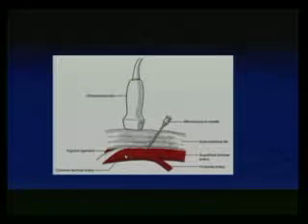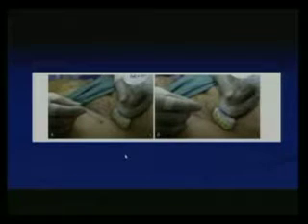So it's easy to see the needle tip when it's very close to the ultrasound probe, but the angle is not right to get your wires and sheaths in. So you have to be very careful when you do that. So this is demonstrating the same concept I just talked about. If it's very close to the ultrasound probe, most of the time it's easy for you to see the needle tip, but you can lose the needle tip as well. But the angle, like putting the wires and sheaths in, is sometimes difficult. So you start a little bit behind to get the access.